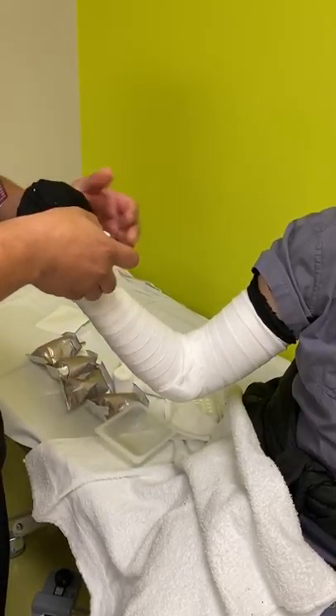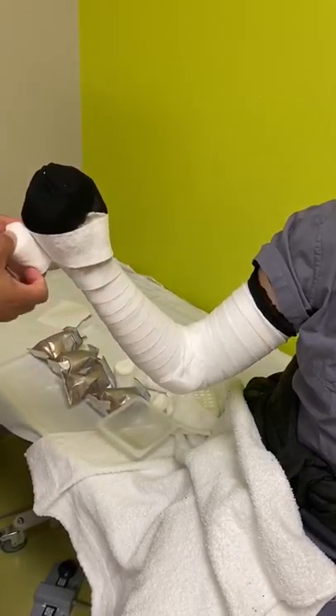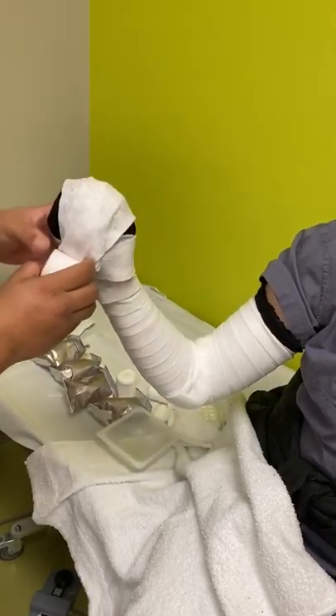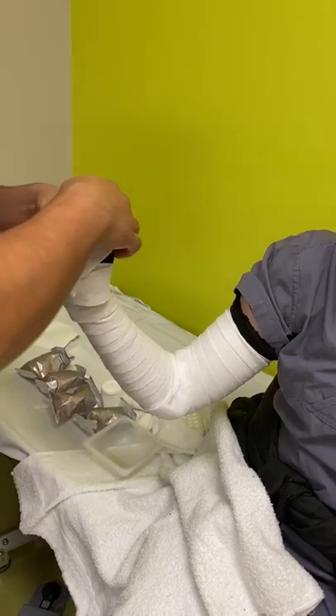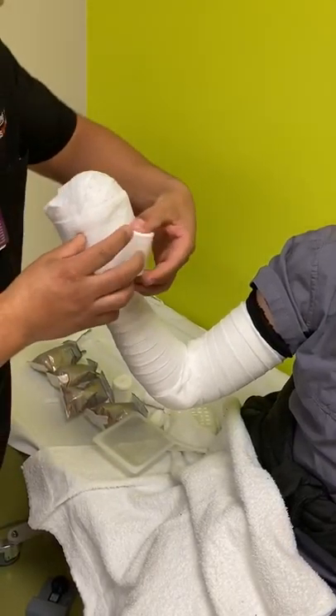Now this sometimes is the trickier part, coming up around the club of the mitten cast. He's going to start fanning, which is when you just fold up and down, making sure that there's plenty of padding around all aspects of the hand.